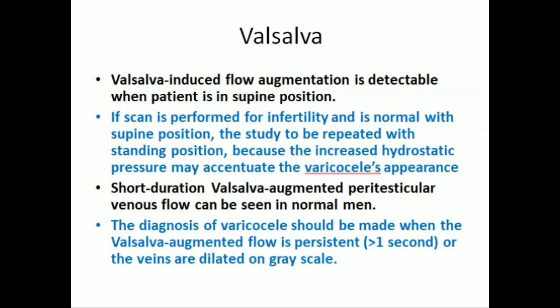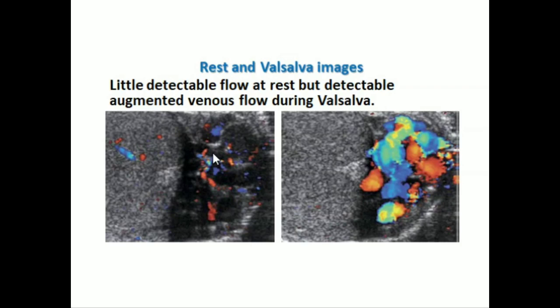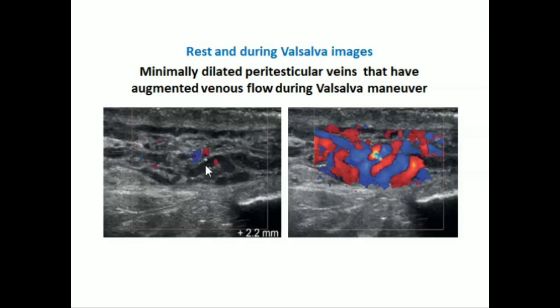Short-duration Valsalva-augmented peritesticular venous flow can be seen in normal men. The diagnosis of varicocele should be made when the Valsalva-augmented flow is persistent for more than one second, or when the veins are dilated on grayscale. These images show rest and Valsalva phases: little detectable flow is present at rest, while detectable augmented venous flow is present with Valsalva. These are also rest and Valsalva images showing minimally dilated peritesticular veins that have augmented venous flow during the Valsalva maneuver.